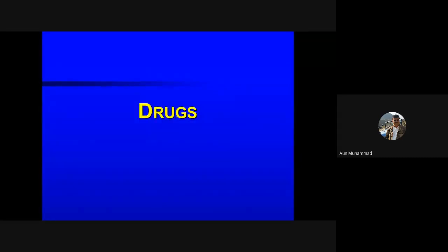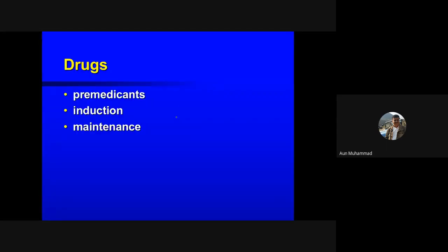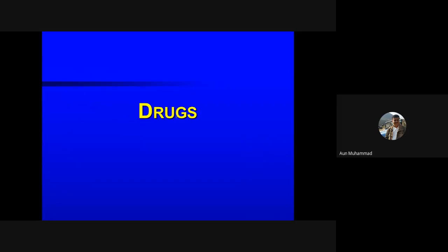So this is about the breathing systems. Basically, there are 4 breathing systems, and inshallah, in our coming practical class, we will be discussing the different drugs which are used as pre-medications, which are used as anesthetic drugs, or which are used for the maintenance of the anesthesia.